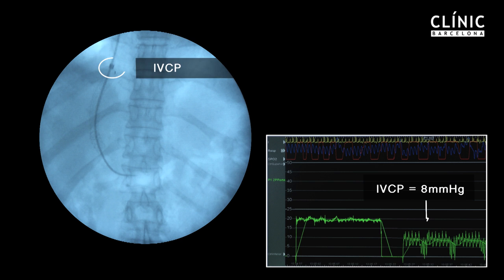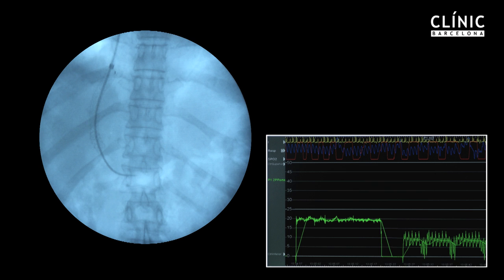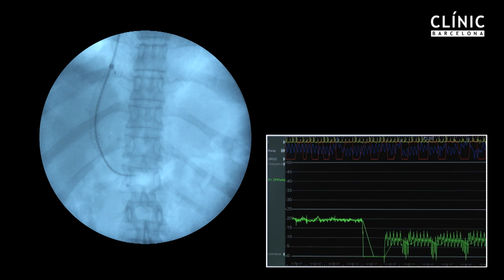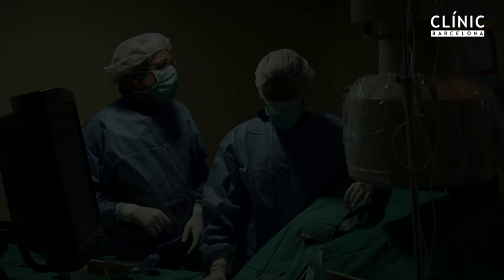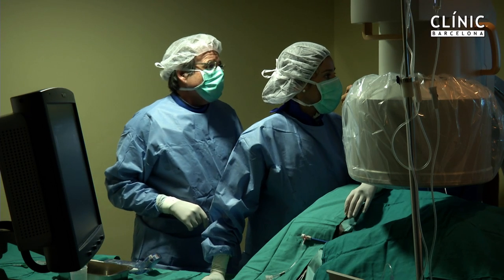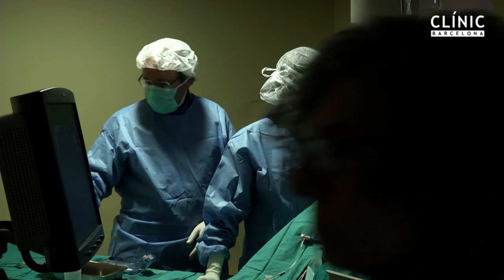This results in a portocaval gradient of 11 mmHg. If the gradient is greater than 12 mmHg, a new balloon angioplasty with a 10-millimeter diameter balloon is used to further dilate the stent, and pressure measurements are repeated.